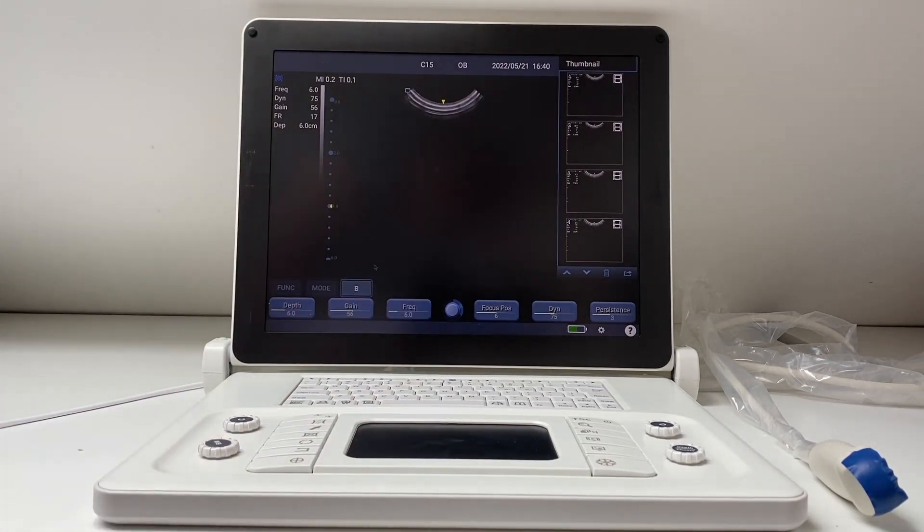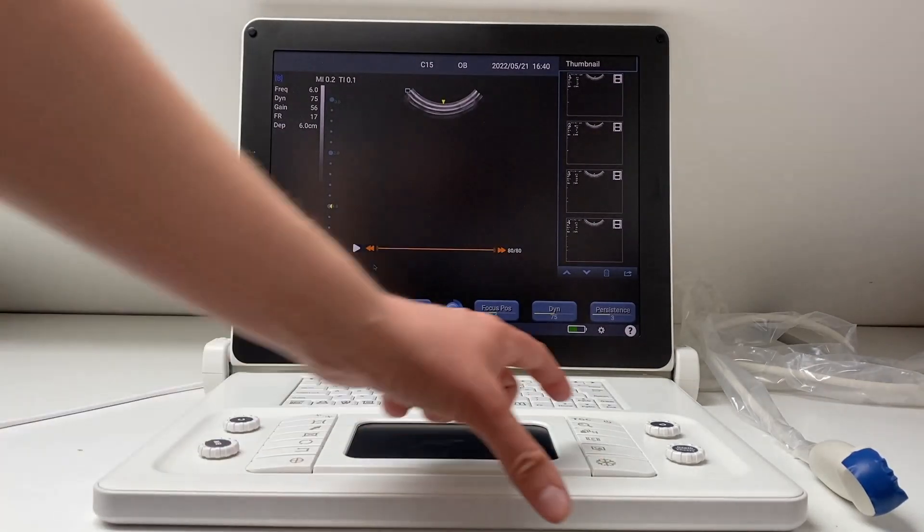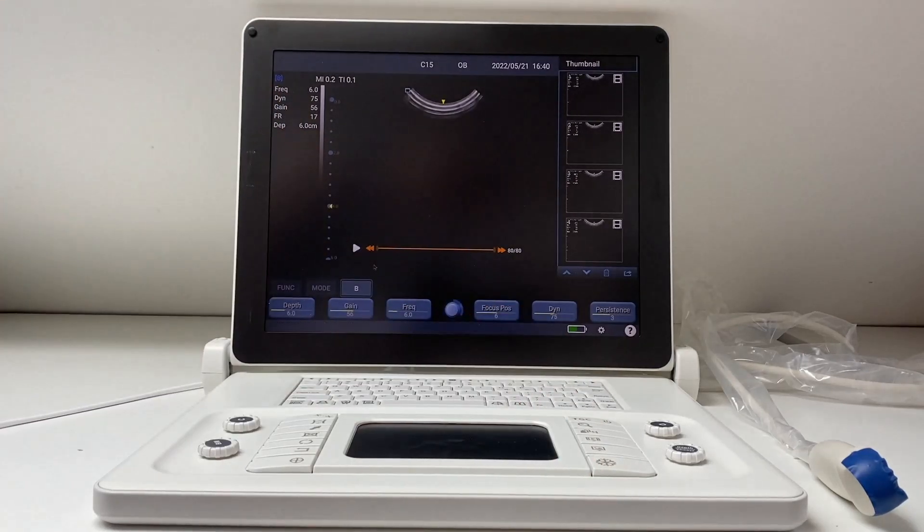The final big change is how quickly you can save cine loops. Simply freeze, press the save cine button here, and watch how quickly it has saved that video clip for you. This is so much faster than the previous scan pad versions and is going to enable you to save a lot more videos during your scans.